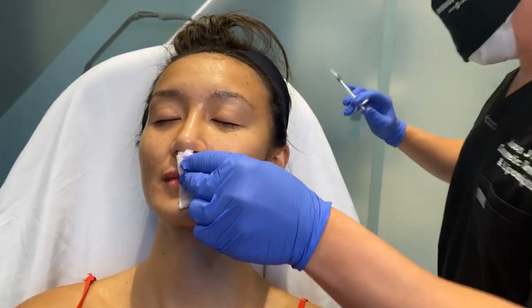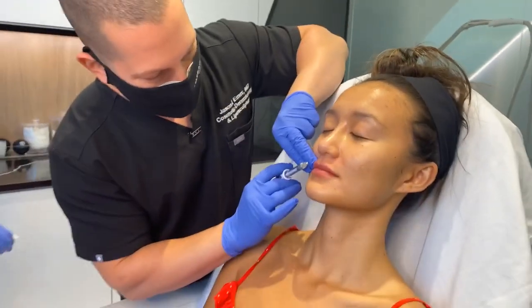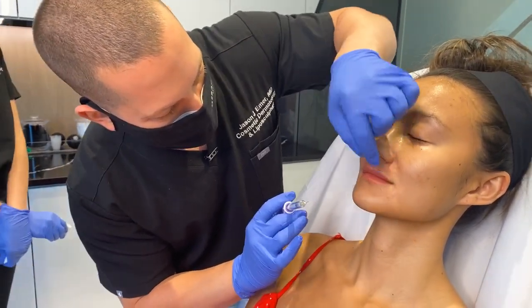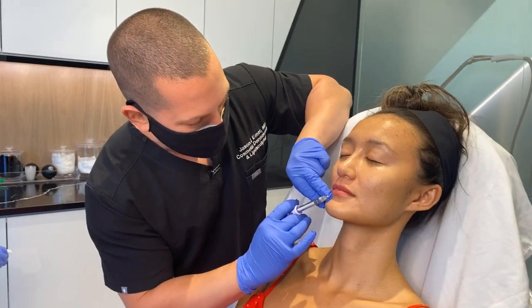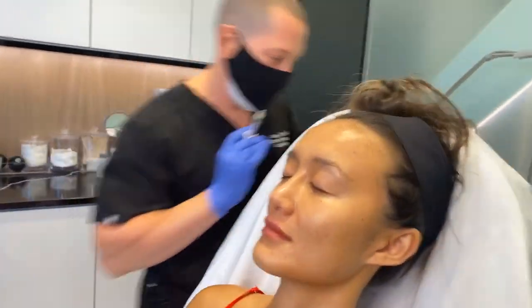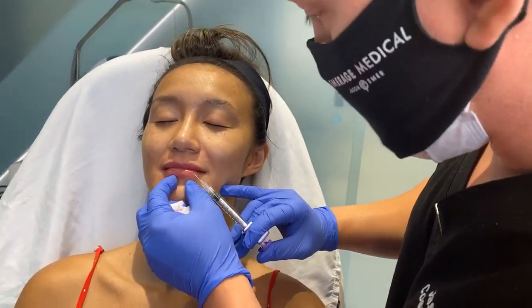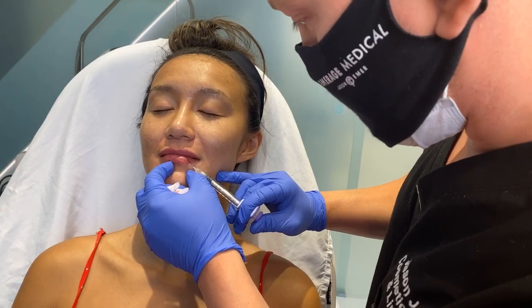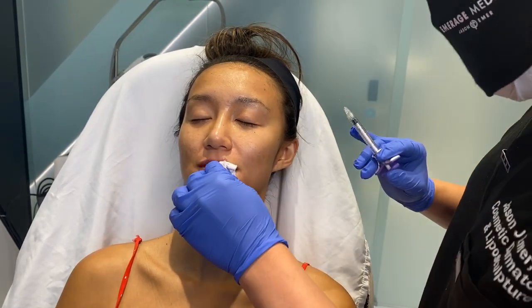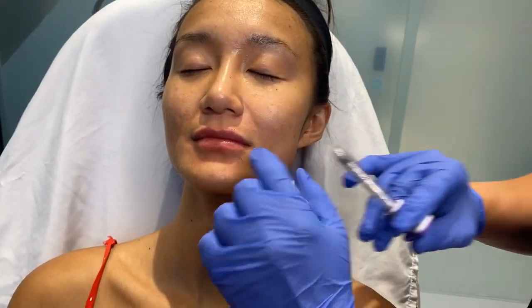How long do these fillers last? Well, we said the Vycross goes 1 to 2 years, typically. But every one is different. On average, the hyaluronics are going to go 6 to 12 months. But this one will be about a year or more, and she didn't do her lips for a year. I think we've done other ones too. I think we've done Silk before. I can't remember. But it's a little softer, and she wouldn't get as much shaping with that. I'll do one more pinch on your fold here. Just a little bit. Okay, so now we'll show her.